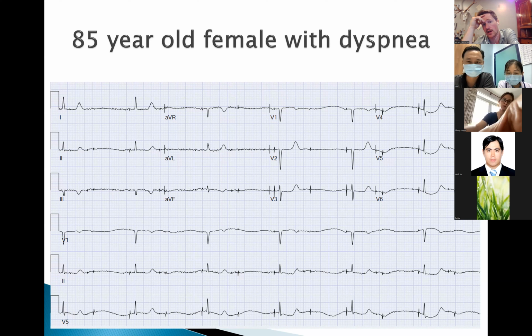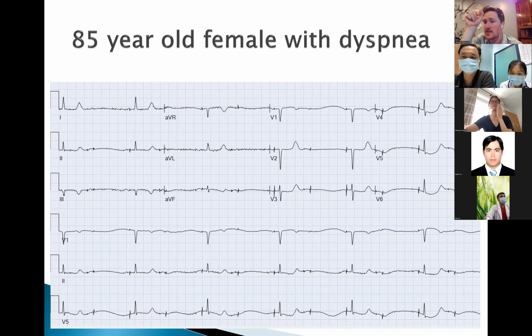Well, we see a spike. So pacing spike before our QRS, but there's a pause in between there. So that makes me think that maybe this is an atrial pacer, because we see that pause and it's not right next to the ventricular. And the other reason I think it's atrial paced is because the QRS is narrow, right? So QRS is narrow. We think probably it's an atrial pace.